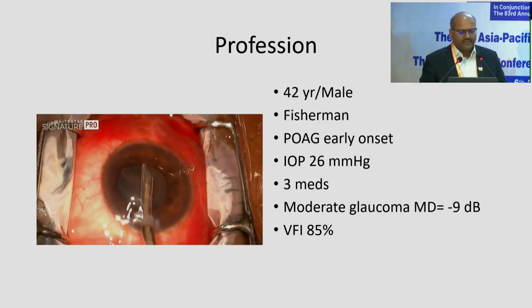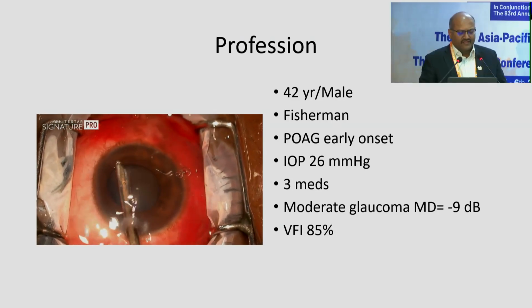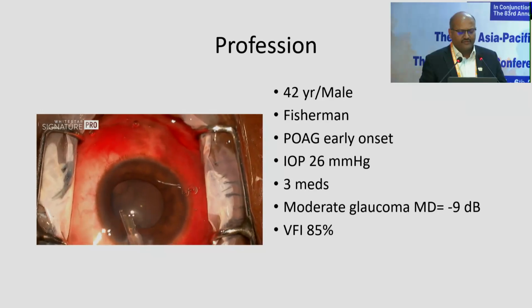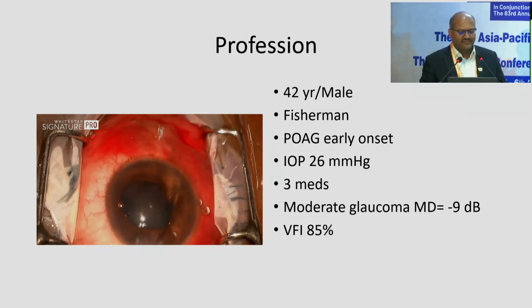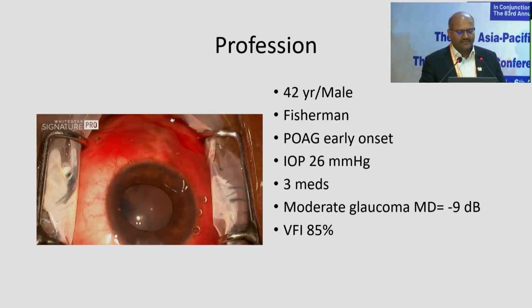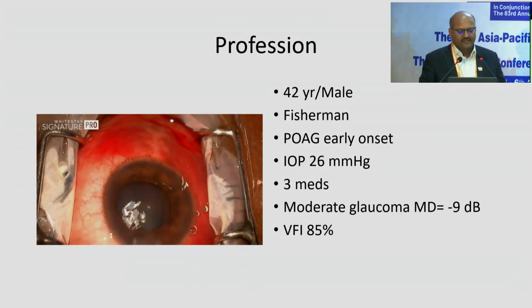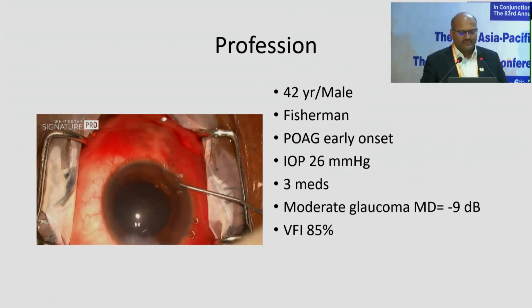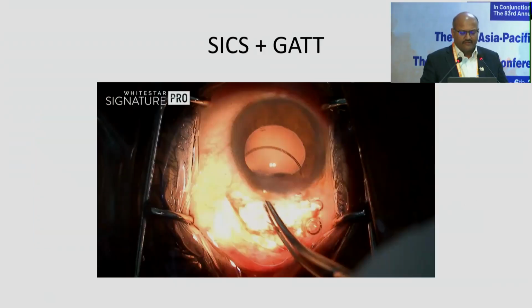of the aqueous humor. Now, we don't test, as Dr. Aparna has shown. I still feel that what Dr. Mandal says, that not even entering the anterior chamber during TRAB is the way to go. So we don't test for the reflux. What I personally feel is that you may damage whatever remaining collector channels there are. So we just form the chamber with sodium hyaluronate, and then we just leave it.